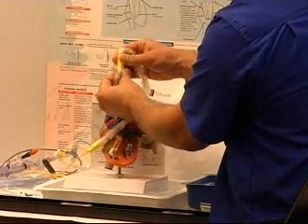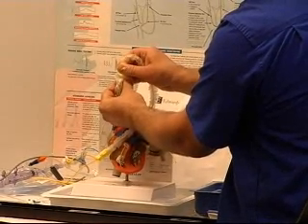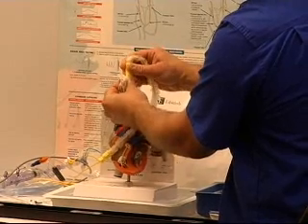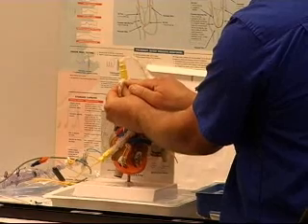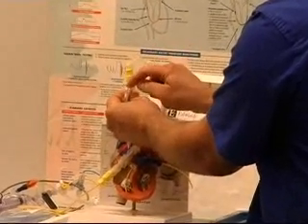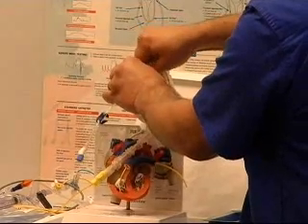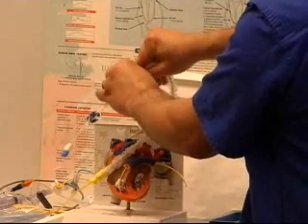So it has 3 positions. Right in the middle is unlocked. All the way to the right and all the way to the left is locked. So what you want to do is find and line up the space on this little cap right here, the sheath, into the middle position, which will be in line with this sidearm. Sometimes it's a little bit hard to get that initially loose, so you have to move it a little bit and wiggle it around.